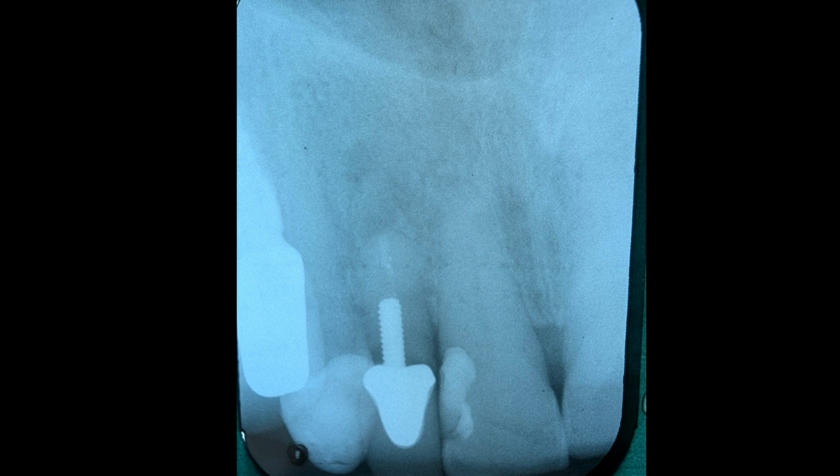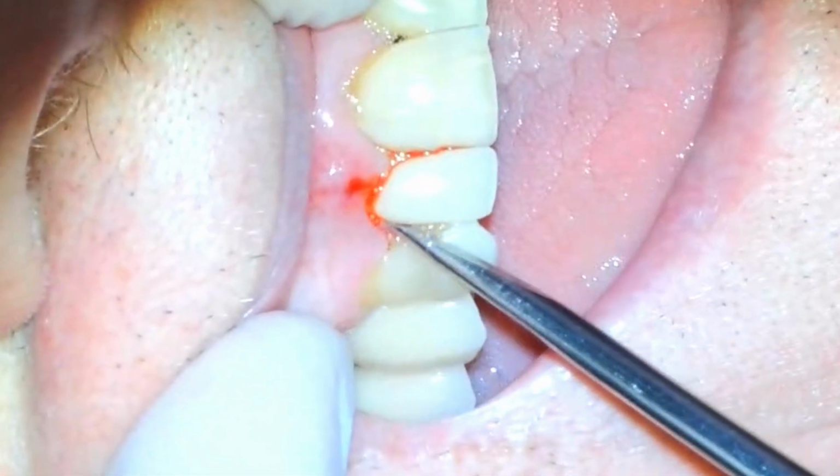So most likely what caused this is a combination of the ginormous post and crown there that you could see. That's a really fat post for such a small root of the lateral incisor. But another reason: the post had been there for a number of years, but he got some decay around it that weakened it. So what was left of the tooth wasn't strong enough to support the post, and he probably bit into something and snapped it. He didn't notice it at first till an infection started, which is right up here, this dark area up in the jawbone. So now that he's here, he noticed it, I put him on some antibiotics for a couple days before he could come in, and now we're going to take the tooth out.